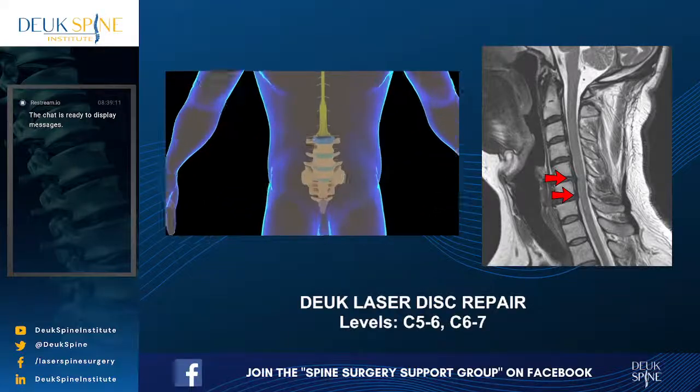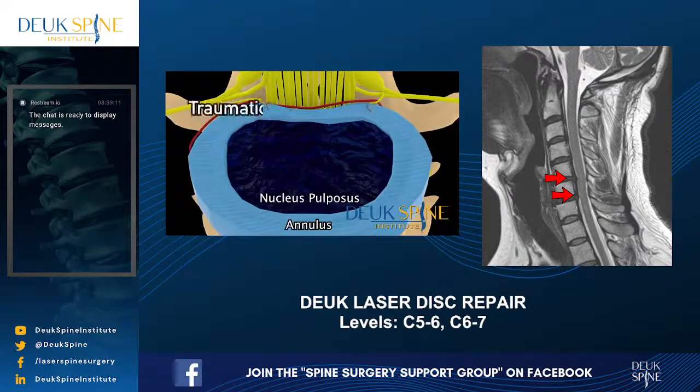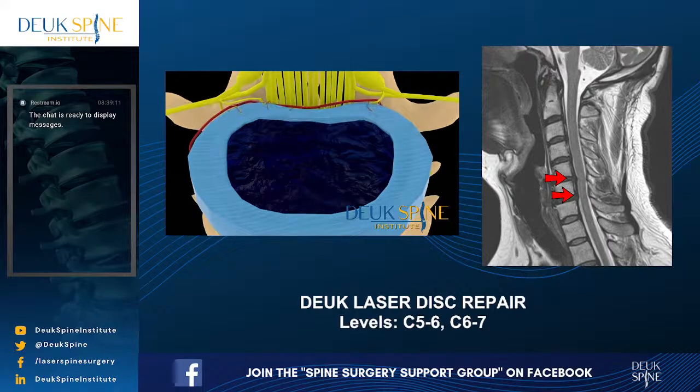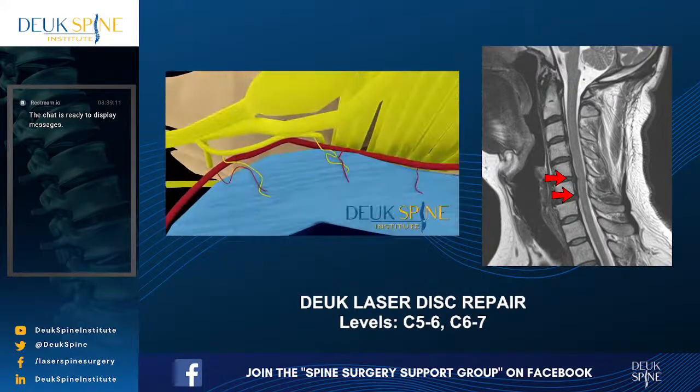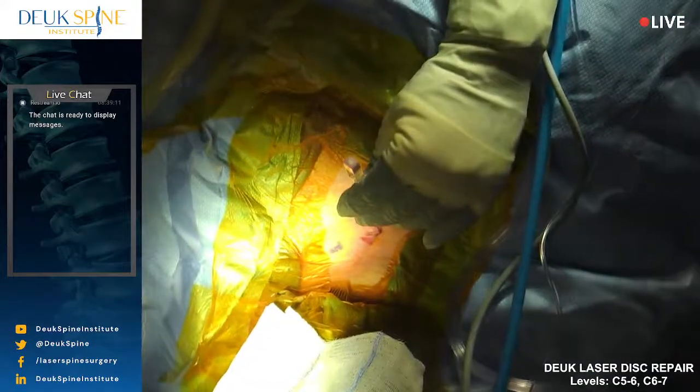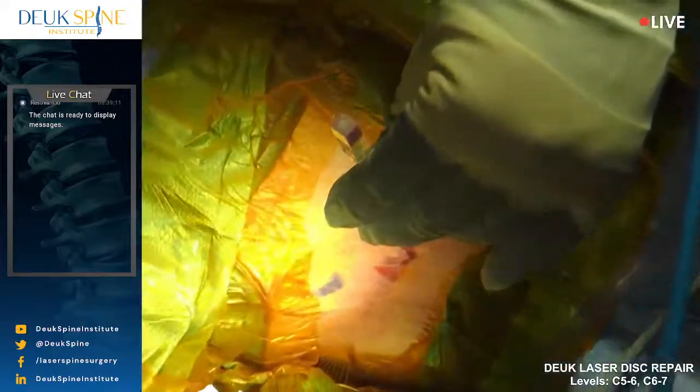We are doing an anterior cervical Deuk laser disc repair. This is a transdiscal endoscopic surgery. Go ahead and take a shot. We're in the middle of localizing to the C6-7, back to a lateral. We're going through the front of this patient's neck. We're going to be doing endoscopic surgery, and we're going to repair 2 disc herniations.